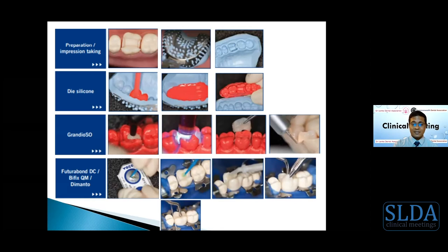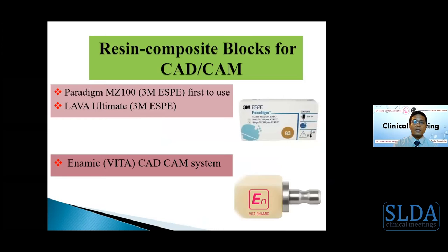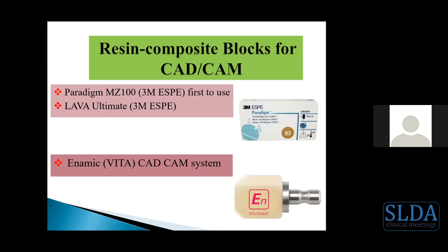Remove interproximal excess, cure it, and do your final occlusal adjustments with this. And with the advances in digital dentistry workflow, there's a dramatic increase in the use of CAD-CAM in modern dentistry. First, composite blocks to use for fabrication of indirect restorations using CAD-CAM system was Paradigm. It came from 3M, and later it was replaced by Lava Ultimate, again a 3M product.